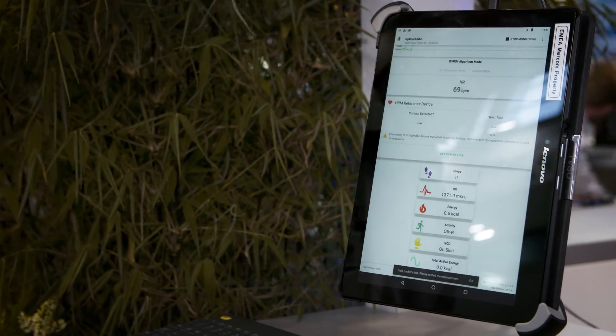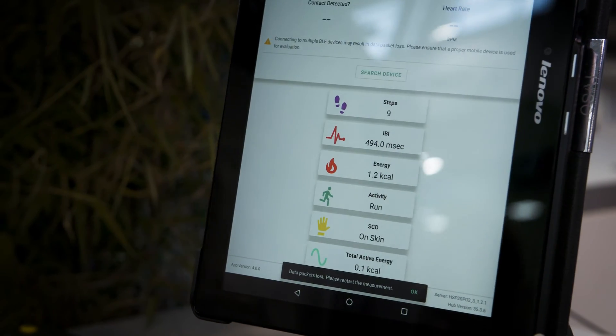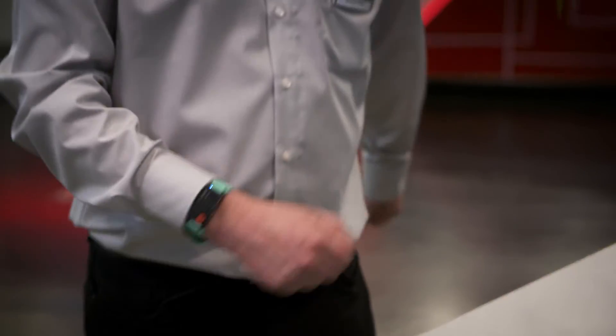If I just start to move, it should see me as walking or running depending on how fast I'm moving. So I am running now officially.